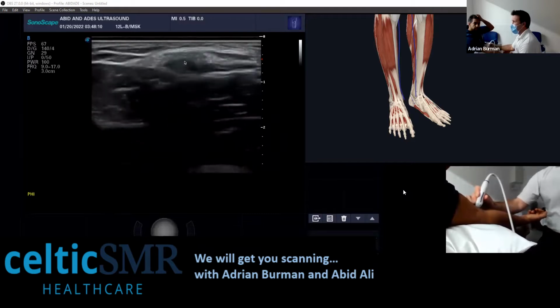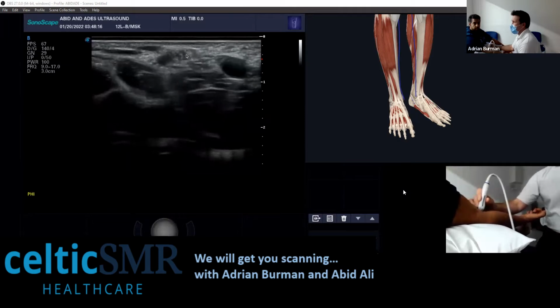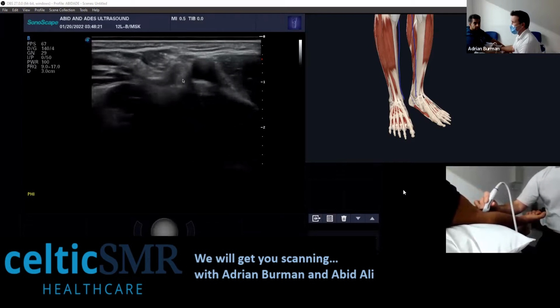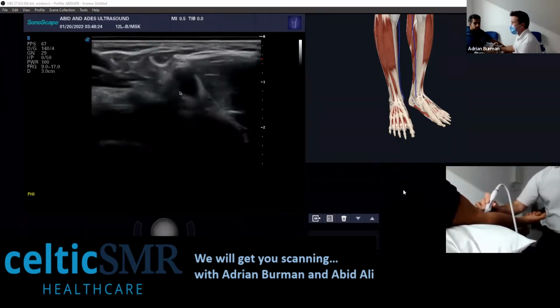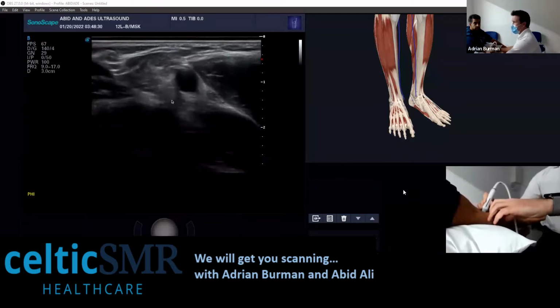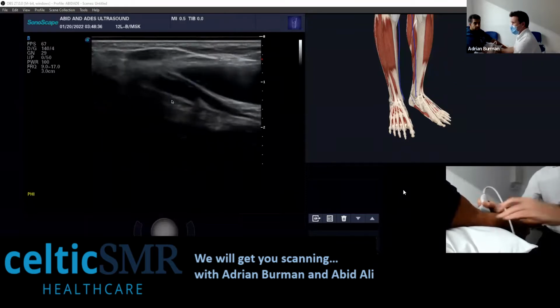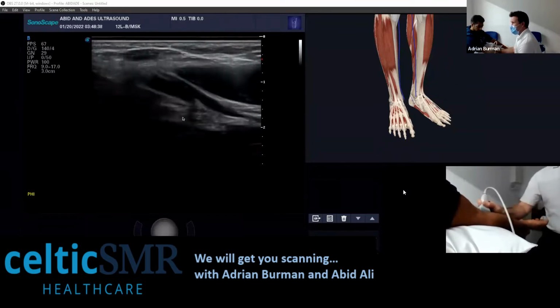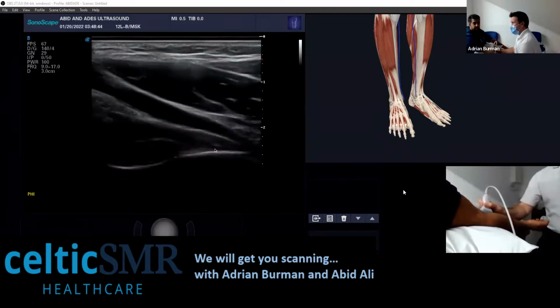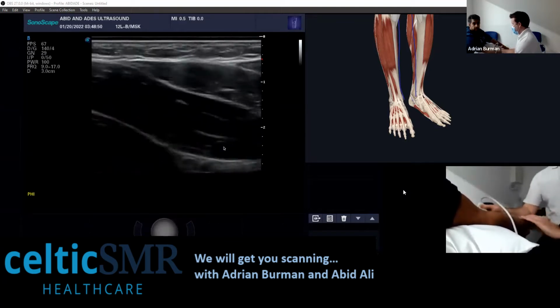Now it's quite difficult to follow this down in transverse. You've got to keep angling and keep angling. It's dipping quite sharply now, you see, so I'm losing it here. And of course, it inserts on the radial tuberosity, so if I come to the side and dig in slightly, then I can do it that way. Coming down here, it's probably feeling that. Yeah, a bit tender there. And then it inserts here. But you can come in from the side, slightly bent.